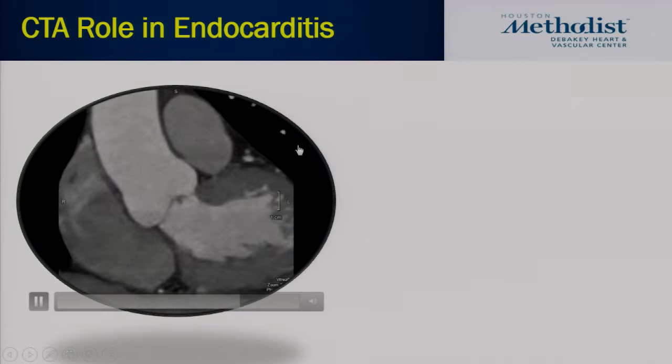Most of the time, patients come to CT, they know that there is something going on, so they're not unknown, although we are always ready for surprises, but they could not figure it out completely on the echo, so they come to CT.